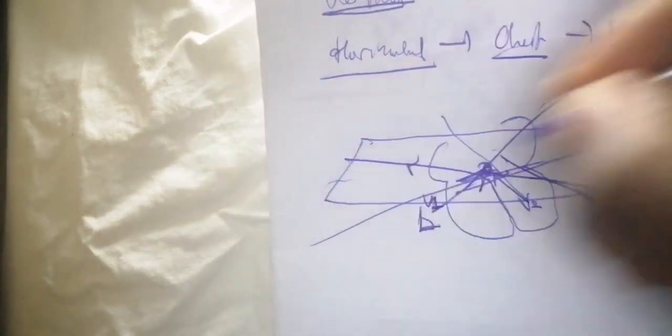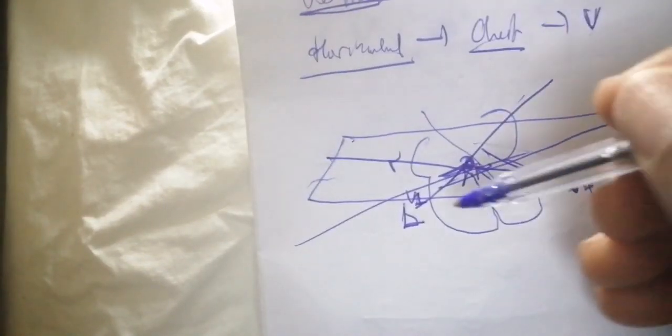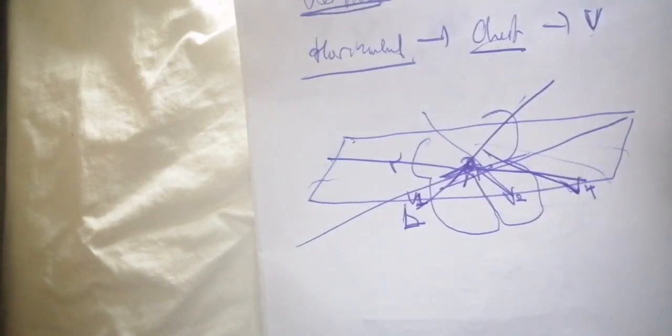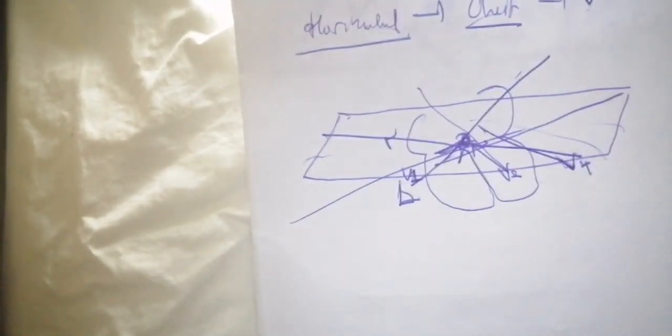Similarly, V4, V5, V6 are going to also move like this. So those are the different visualizations of the heart on the horizontal plane. They have different angles at which they visualize the heart on the horizontal plane. Is it clear? That is why they are going to have different ECG graphical representations of those different leads on the ECG paper. Is it clear?